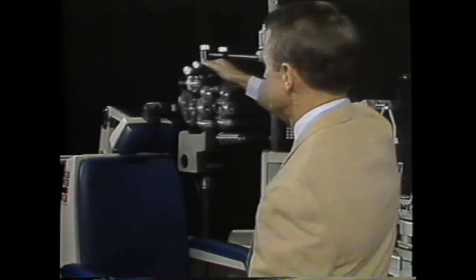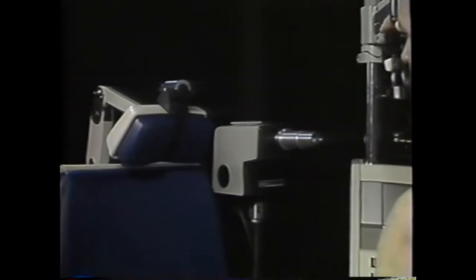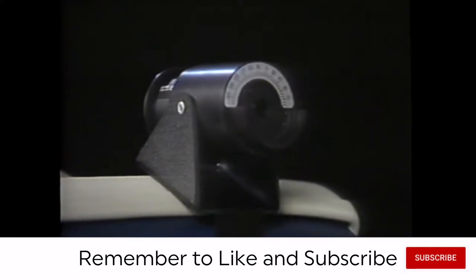The easiest way to learn retinoscopy is to use a refractor or phoropter with a so-called schematic eye mounted behind. For example, this schematic eye from the Burnell Corporation is easily positioned and taped on the examining chair, keeping it pointed straight ahead.